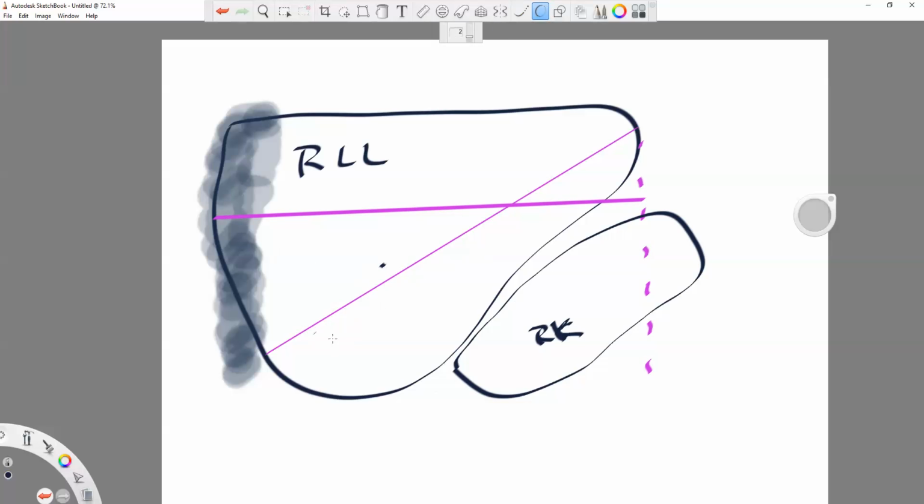So what I'm trying to do is the best as I can. I'm trying to get my students to at least image a liver so that we're going to mitigate the amount of shadowing we have to deal with. Maybe there'll be some shadowing, but not as much. So in other words, we're going to try to see higher and manipulate that transducer, manipulate the patient's breath and everything to the point where we're starting to see more.